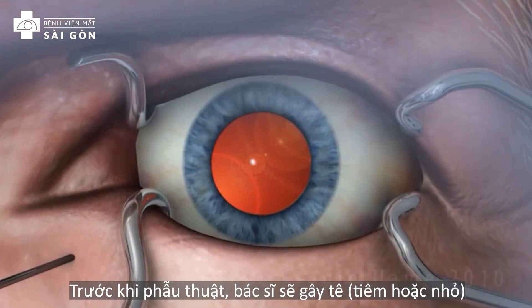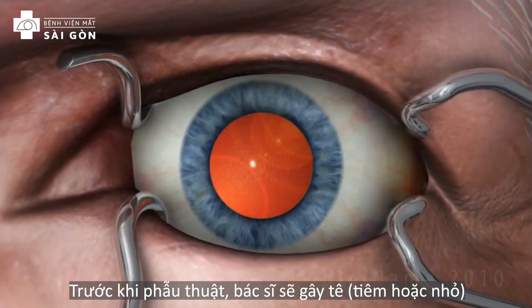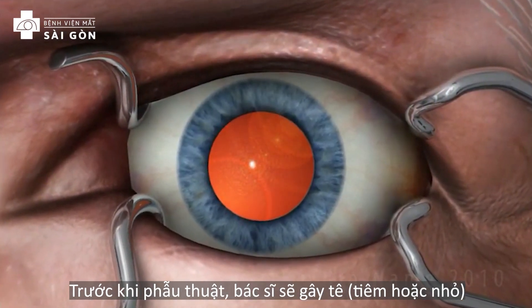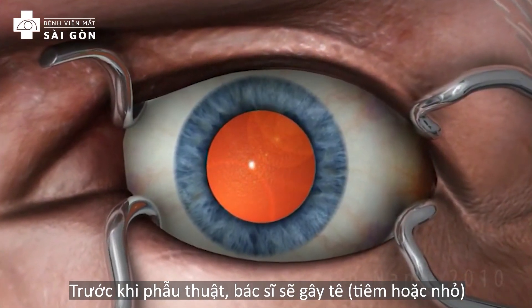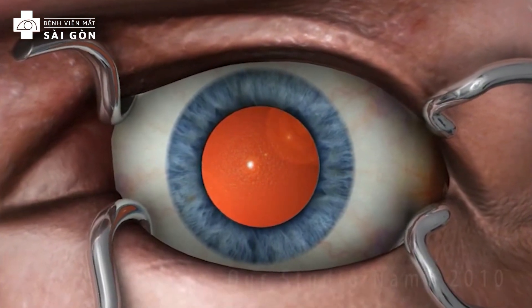Pressure may also be applied to decrease the internal pressure within the eye. This will lower the chances of complications later in the surgery.